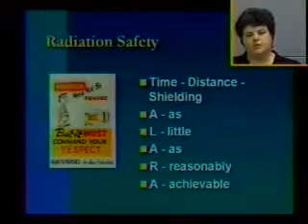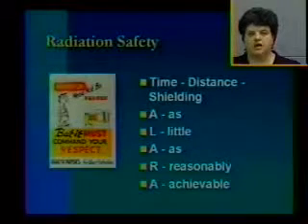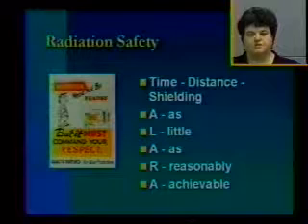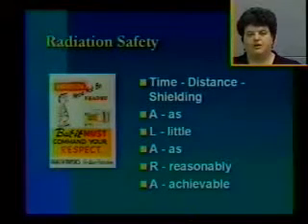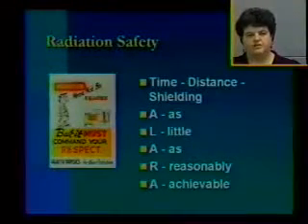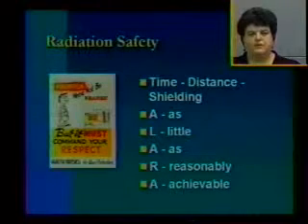And then shielding means wearing lead aprons, lead goggles, and gloves. Just a quick note on gloves. Gloves do not protect you from the primary beam. So if you actually are holding an animal and your gloved fingers are on the beam, you are actually receiving quite a dose to your fingers. Just something for everybody to remember.